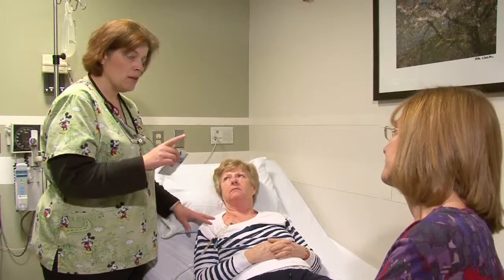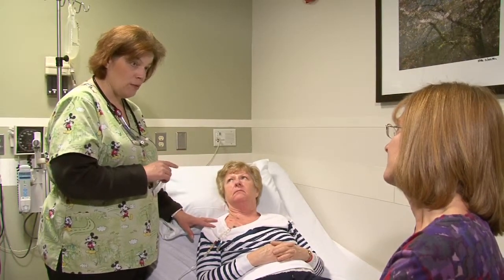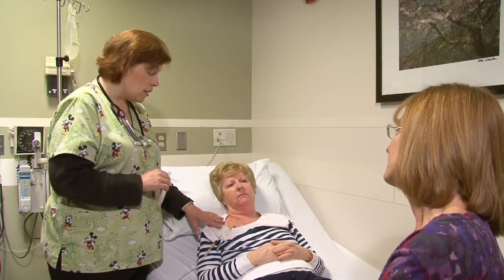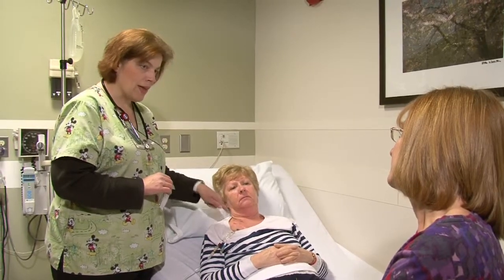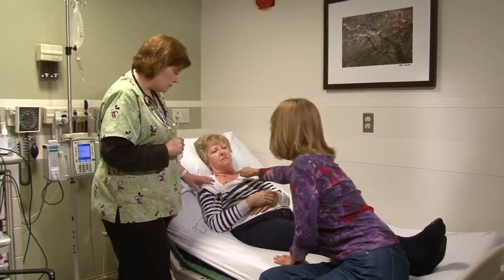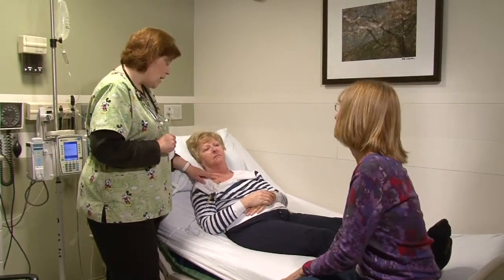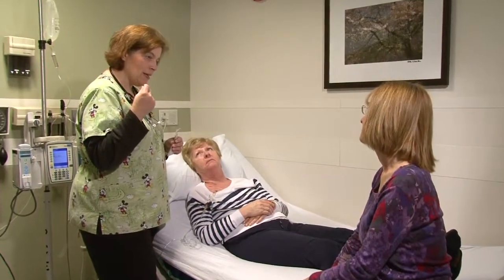Your healthcare provider will discuss with you whether or not you or other caregivers will need to provide central line care while you have the central line in place at home. The care given by healthcare providers might be a little different from how you are taught to do central line care. Healthcare providers must follow specific principles of care for central lines to avoid complications. These principles should be followed every time by care providers in any setting while caring for your central line.